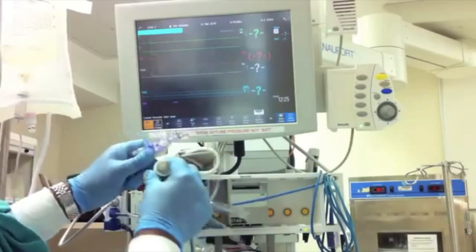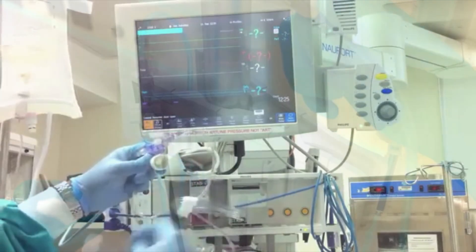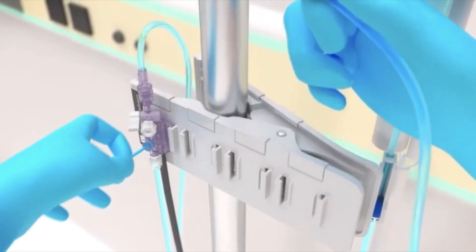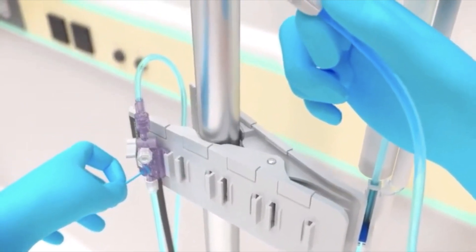The pressure tubing is attached to the corresponding color-coded port. Number 10: The pigtail is pulled and the catheter is flushed, removing all air.